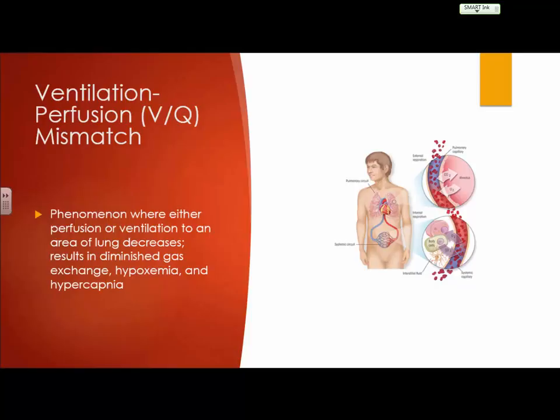If I'm hypovolemic, and I don't have as much preload coming back, so then I don't have as much blood going through the right side, and I don't have as much blood coming to the alveolar capillary membrane, then I'm going to expect my CO2 to be lower because I've got a lower amount of volume, right? In turn, I'm going to expect my perfusion status to be lower, right? Which is totally the definition of shock, inadequate cellular perfusion, hypoperfusion of the cells.